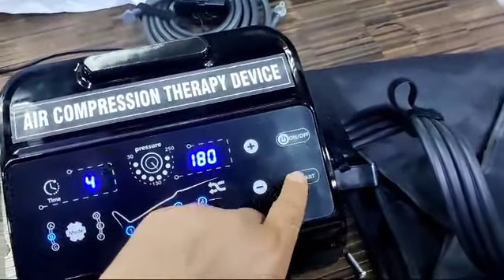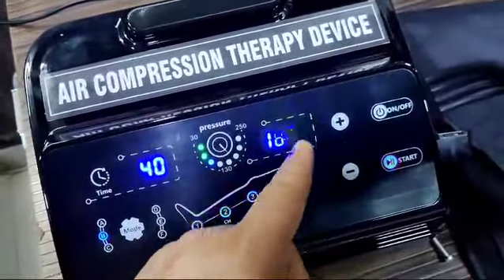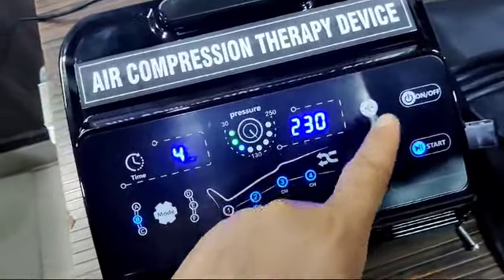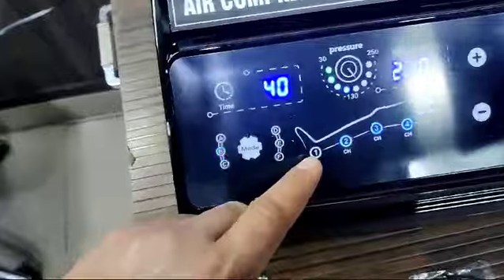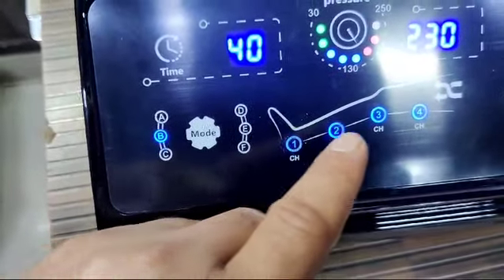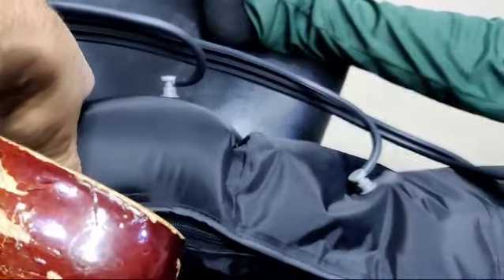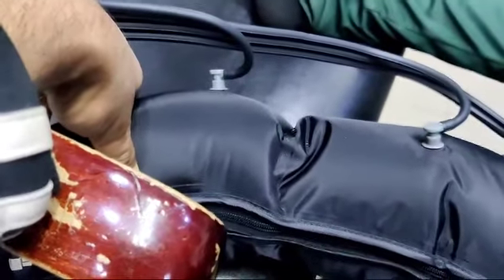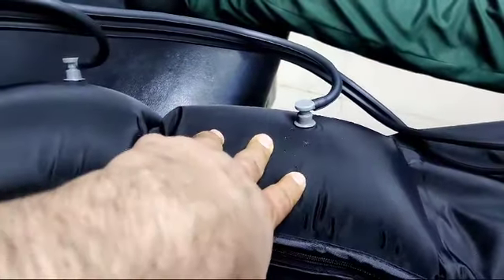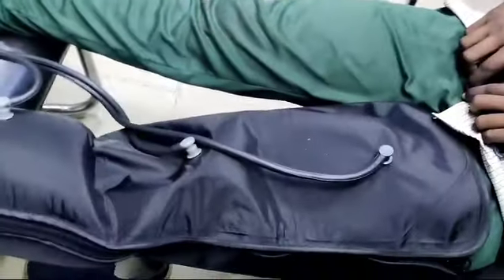Now I am starting the machine. You can see I have set the pressure to 180 and am increasing it to the maximum. Chamber one is showing inflated while the other chambers are deflated. Chamber one is totally hard and inflated. Now chamber one is getting deflated and chamber two is getting inflated, then chamber three, then chamber four.